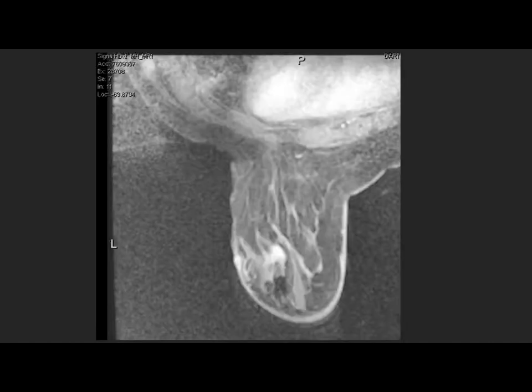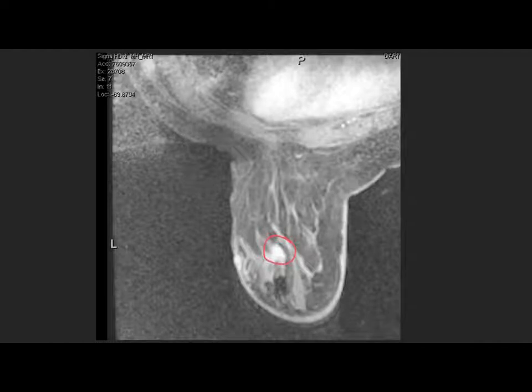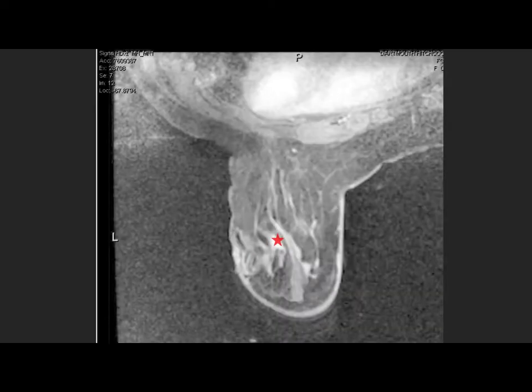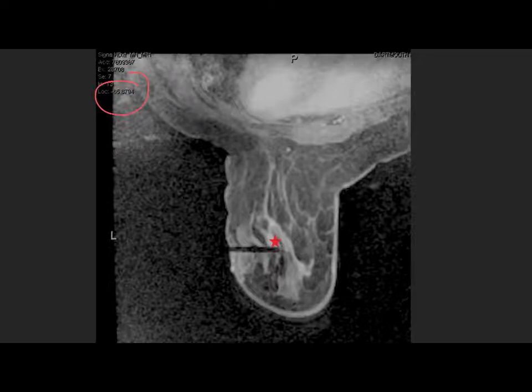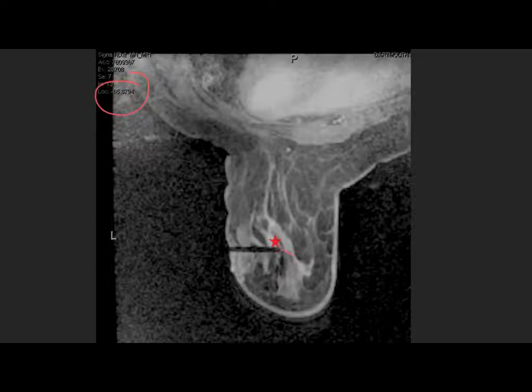Challenge number two. Here is a series of images. Here we have our lesion marked with a star — this is an image obtained after we've placed a fiducial, and you can see there is no fiducial in this image. Scrolling inferiorly, here's our lesion. Getting more negative on our particular machine means going more inferior with the transaxial slices, and you can see we're now through the middle of the fiducial. I'm actually significantly inferior to this lesion. You can calculate how many millimeters from the sagittal images — I'm pretty good in depth position, maybe just a tiny bit deep or medial, but I am definitely inferior.